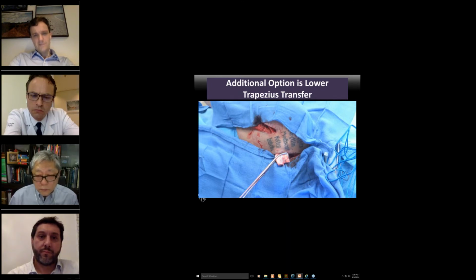Why? Because when you put these anchors, when you put the suture in the Achilles tendon, if you have an implant, many times you don't have enough bone proximally. But when you drill with the endo button, you can go around the implant, you can cheat around to be able to go from the back to the front. It will give you a nice leverage this way.